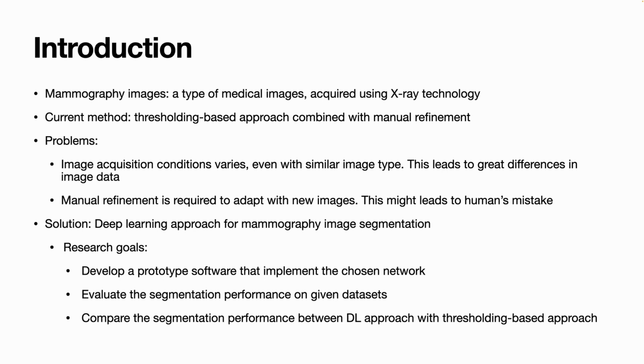Therefore, the output of this work is a prototype software. This software will implement a deep learning model to perform segmentation tasks on mammography images. The developed software should provide comprehensive options to study the dataset, pre-process the images, perform model building, and then evaluate the results.